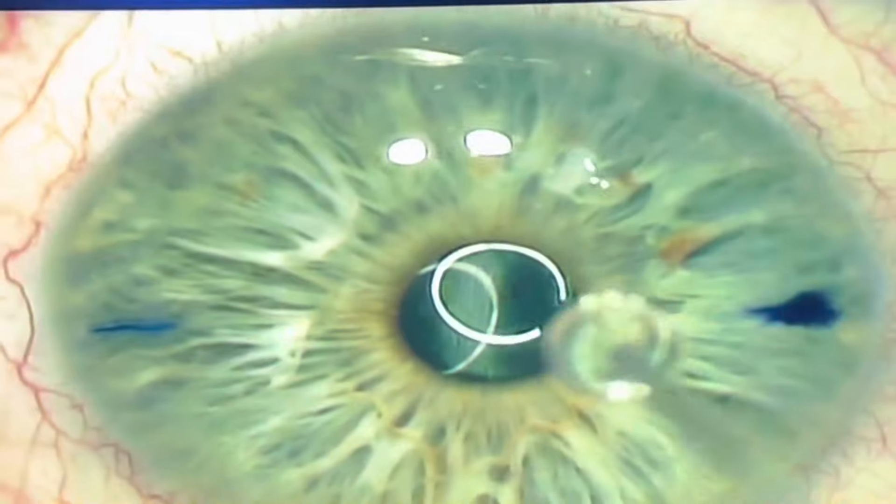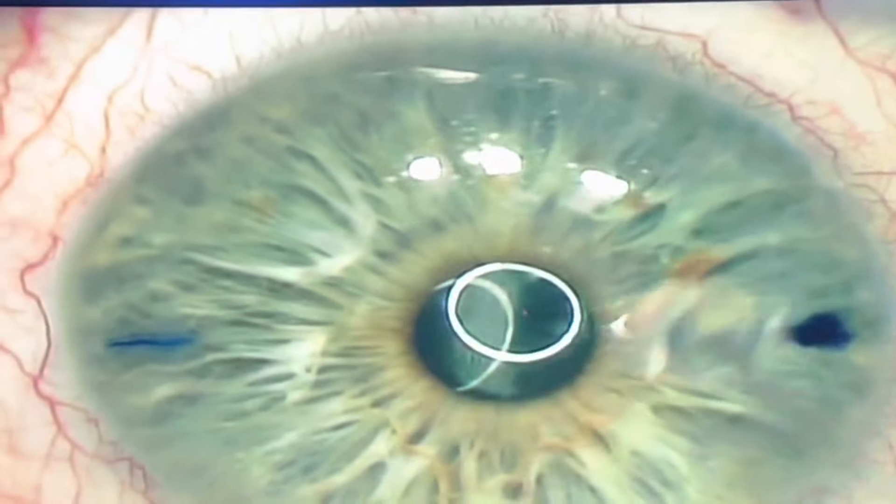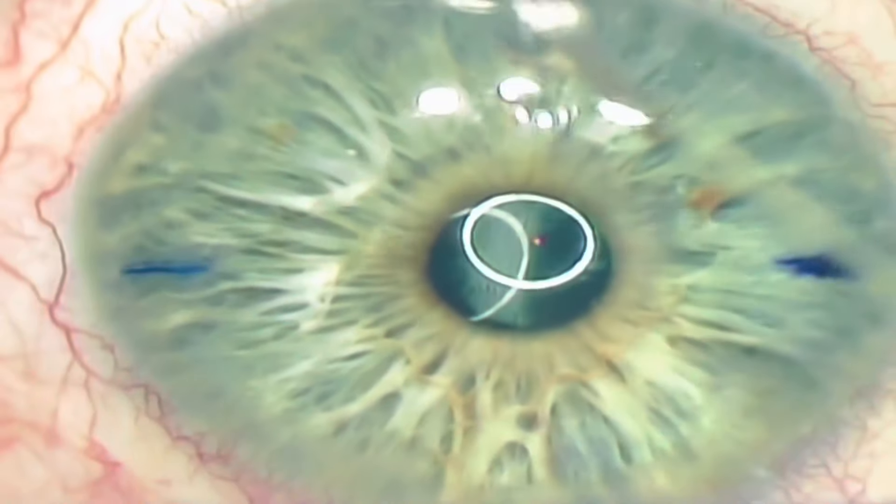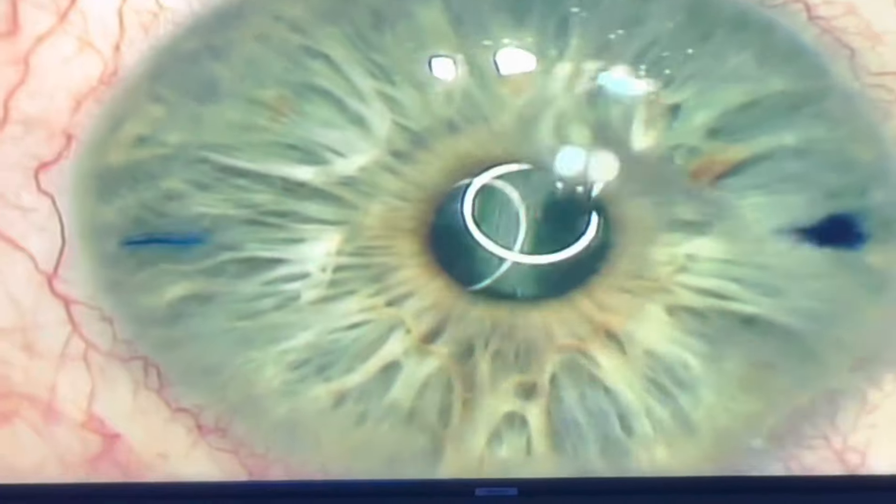After this, watch. You can see what was a completely absent and irregular reflex has become a perfect circle, what I call circle of sight. You can see the image underneath of the lens in front, and you can see the very ectatic area here and here that we have disregarded by shaping them.